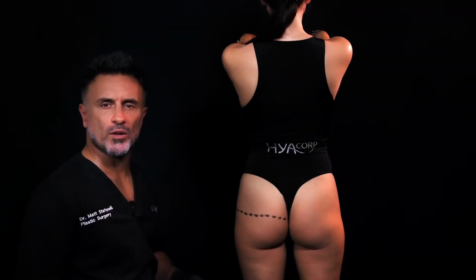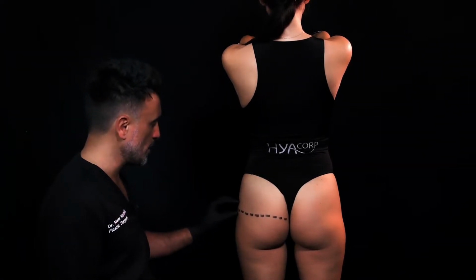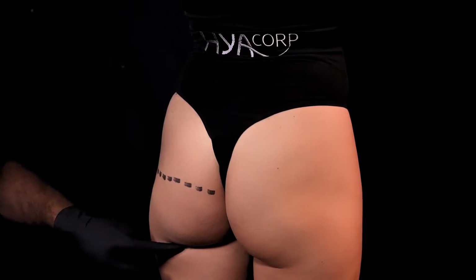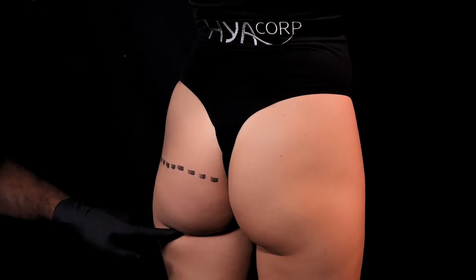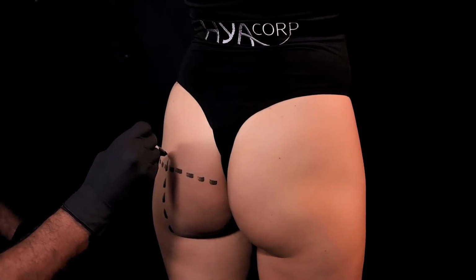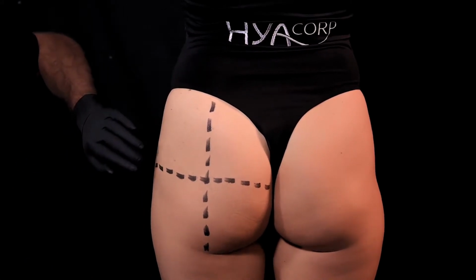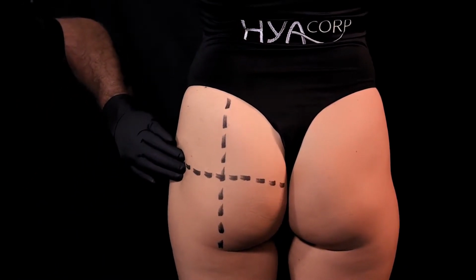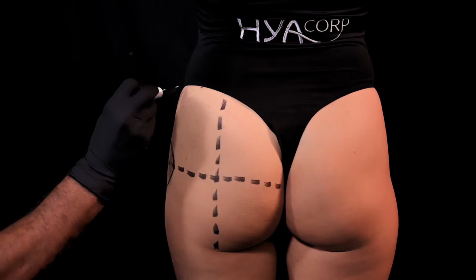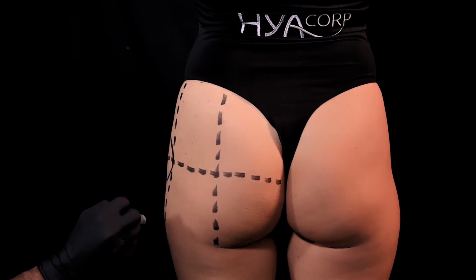It's particularly relevant when we inject the hip dips, but as I said before, in Rada we are not going to inject the hips, just the lateral butt. The second line is passing by the midline of the butt, and very often the midline of the infragluteal fold. So in this case, we can see that this line is here. And the last line that I like to show you a little bit from 3/4 is dividing the lateral butt from the hips. Here I can easily palpate my greater trochanter. So I like to make a last vertical line passing by this trochanter.